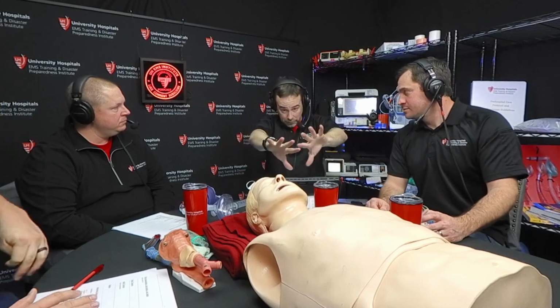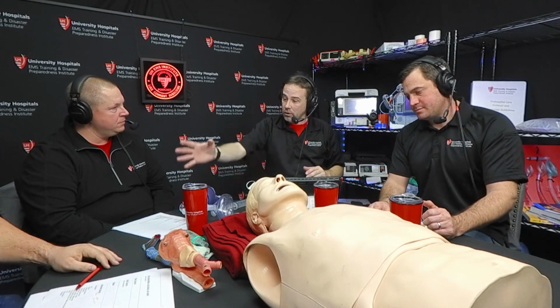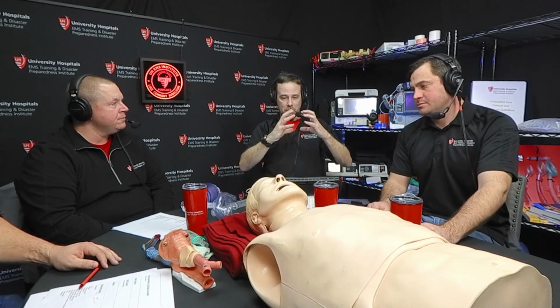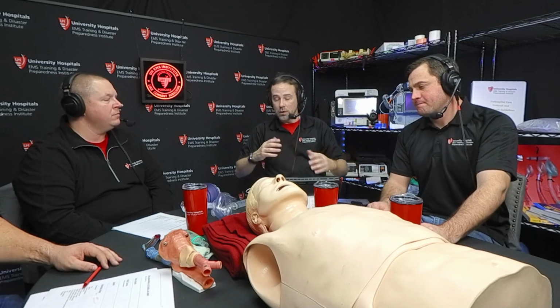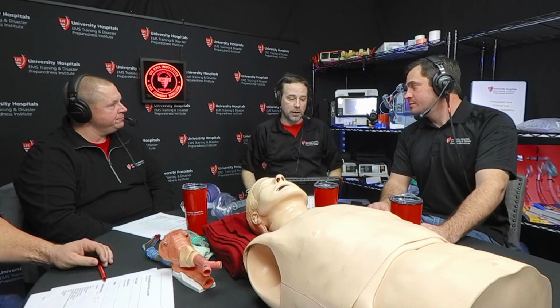Except instead of actively pushing pressure down to keep it popped open, you're just going to keep some of the pressure in the circuit when you exhale. So it pops it open, and then it allows you to start to exhale, so you do get gas exchange, but it traps some in the lower airways to still keep that expanded, right?